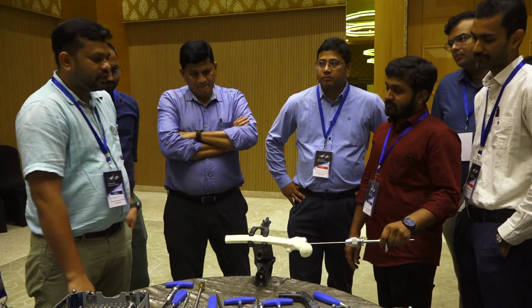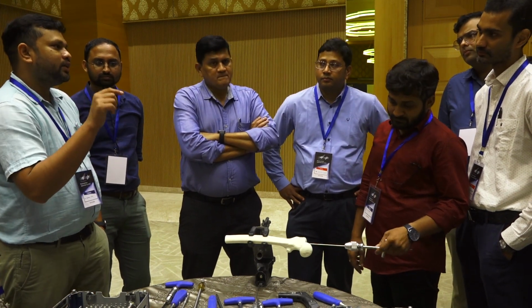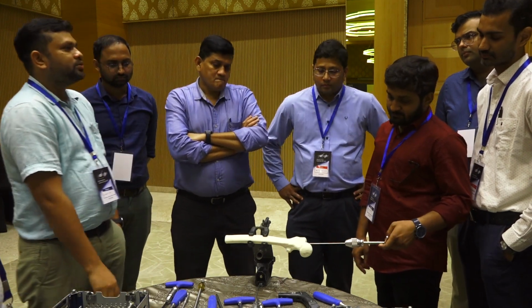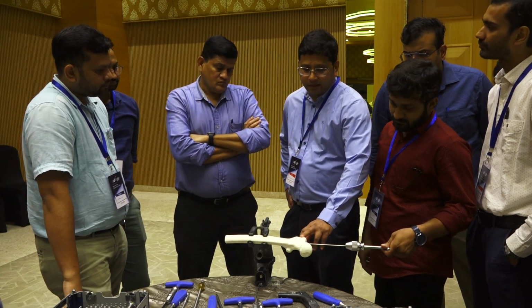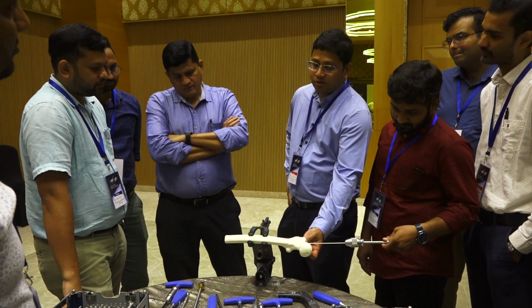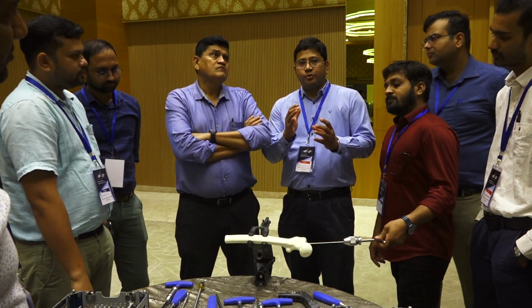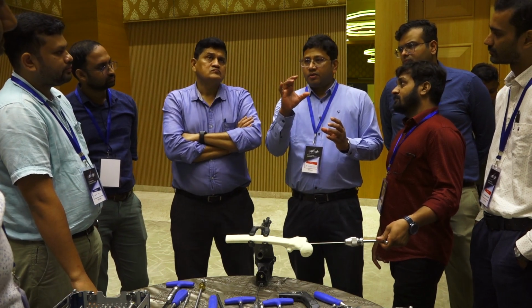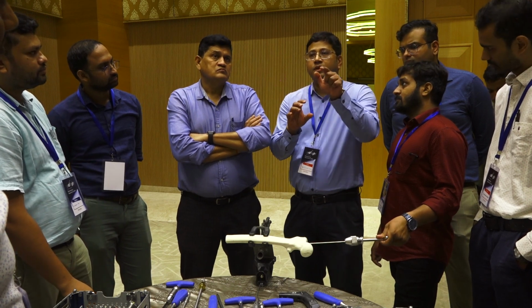And one more thing, with the anterior entry, we feel difficulty while putting the screw or helical blade in the posterior part. That is the most crucial part too. And I think the majority of the bone stock is good. Thickness on the bone stock is good on the posterior side, and personally, I feel a little more posterior is more beneficial in the sense I would like to reduce the GT, greater trochanter, and see where I can get a good entry point without getting into the fracture zone.